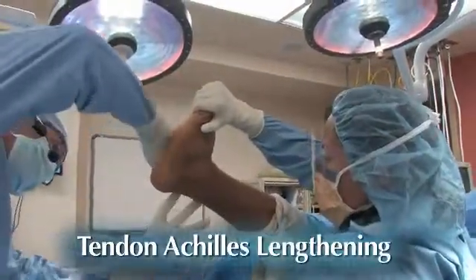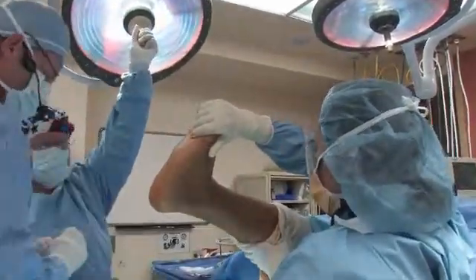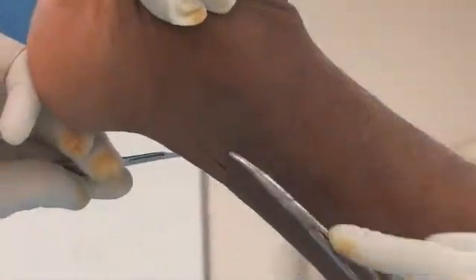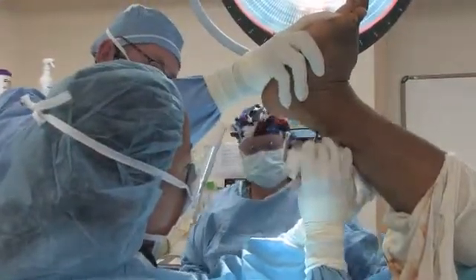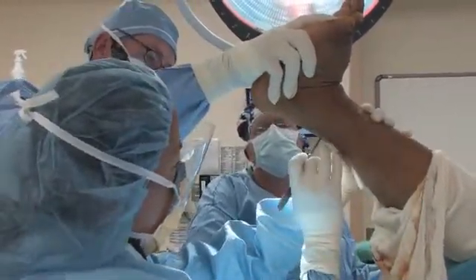We use a 3 incision approach here. So I'm going to hold this leg so she can work around those 3 incisions. You'll be able to feel the release with literally a 10 to 15 millimeter gap here as soon as she releases. I'm putting dorsiflexion on the foot and you'll feel it release. A little bit on that side, right there. I'll give a little bit.